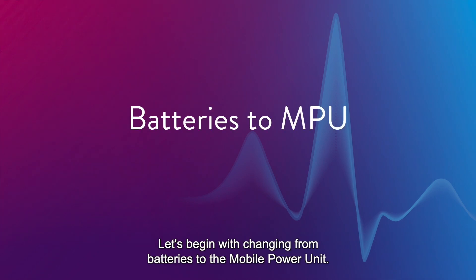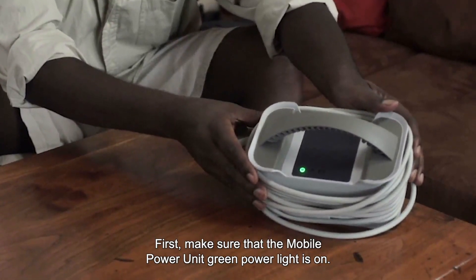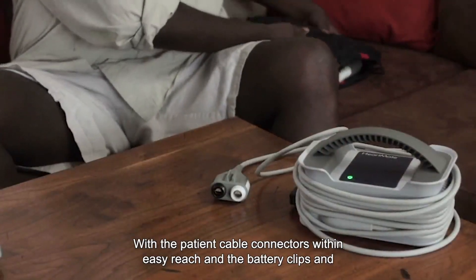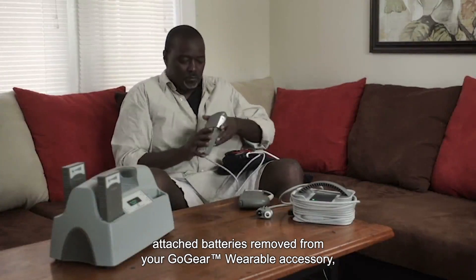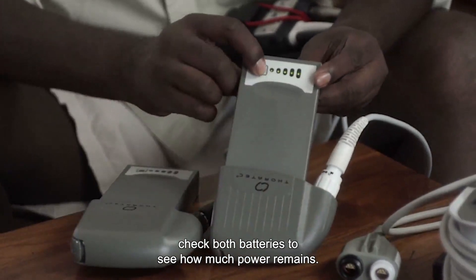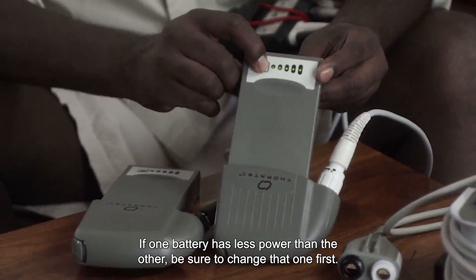Let's begin with changing from batteries to the mobile power unit. First, make sure that the mobile power unit green power light is on. With the patient cable connectors within easy reach, and the battery clips and attached batteries removed from your GoGear wearable accessory, check both batteries to see how much power remains. If one battery has less power than the other, be sure to change that one first.